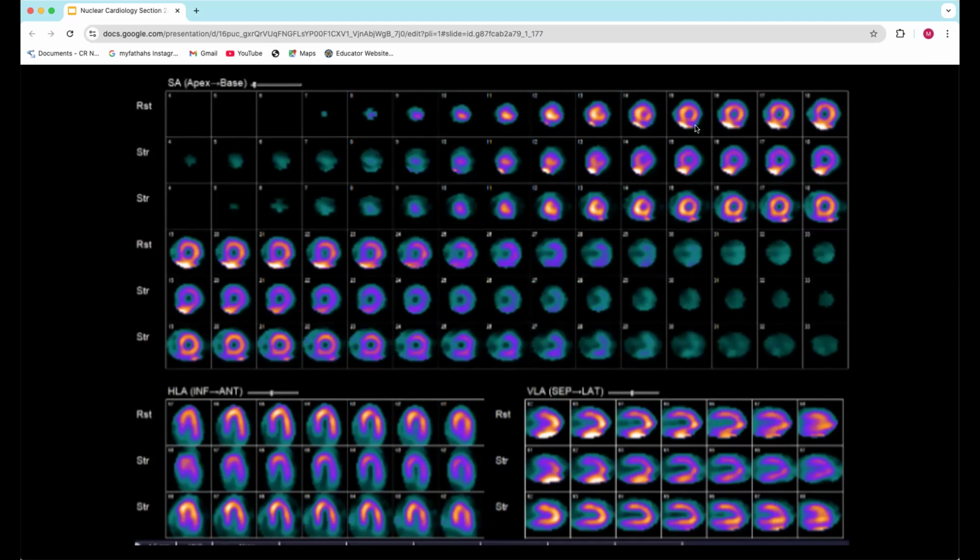But you can see on the inferior wall and where the gut is here, you can see that there is some separation there. And this is kind of where a tech probably just made a call and they felt like they could see it good enough that they decided to move on to the stress. I will tell you, you should have waited on this one. Now, there are times where you wait 30 or 40 minutes and you give your patient a drink and it still comes back looking not great. And sometimes you have to just take it. You just have to go with what you can have. Everybody's physiology is different, their anatomy is a little different, and so you have to take it, right? But if I saw this exact picture, I'd probably try to do all those things. So we'll just give this tech the benefit of the doubt and say they did all those things, okay?